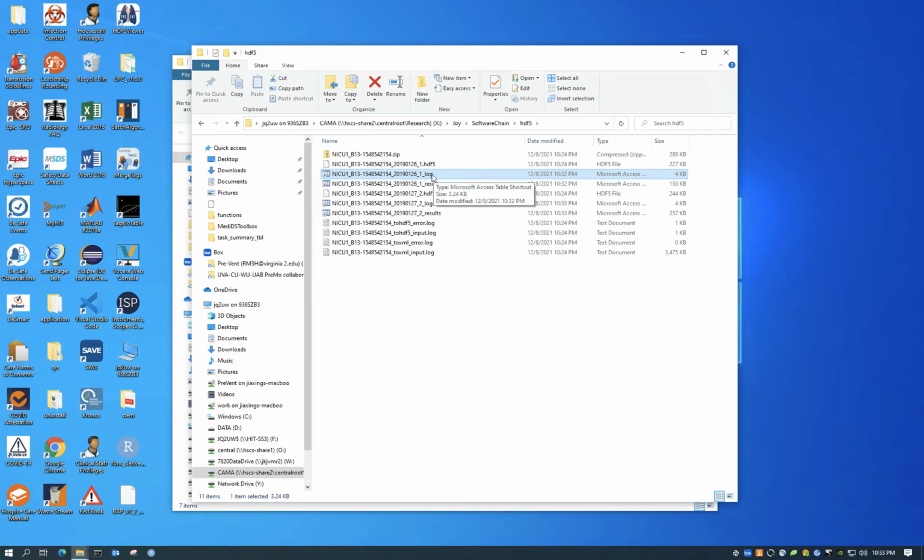One will be a log file in MATLAB structural data format, and a result file that has all the interesting tagged events and other signal statistics. So for each HDF5 file, we have one log file and one result file.